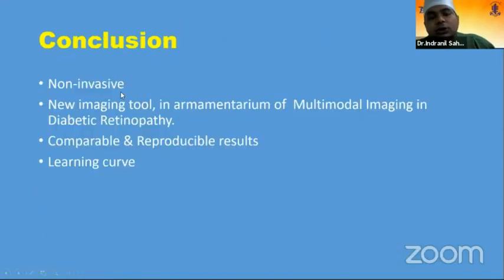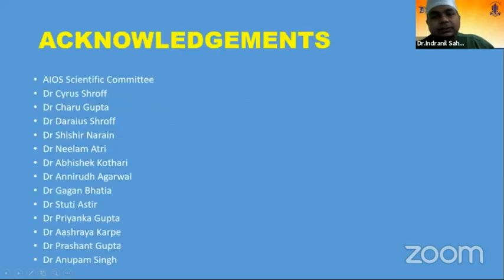To conclude, OCT angiogram, as already highlighted by the previous speakers, is the new tool in the armamentarium of multimodal imaging, a non-invasive tool with comparable and reproducible results. It does have a learning curve, where we need to understand how to get the image of interest, segment it well, and reduce the artifact component.